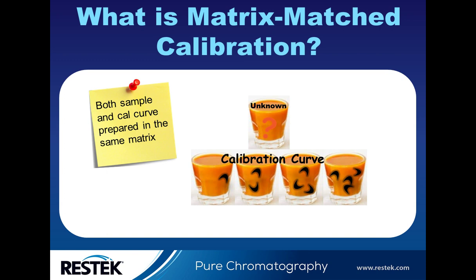However, before you do the extraction or do the official study, you have to make sure your absolute extraction recovery is ranging from 70 to 120.